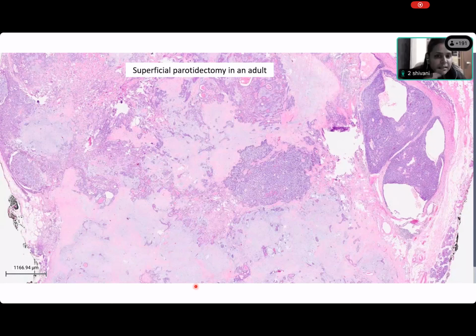Ma'am, there are cells which arrange in light and dark. Light and dark. Okay. Akshara? On the right side, there are these lobules of basaloid-looking cells. Basaloid-looking cells on the right side. Yes. And what do you mean just by basaloid-looking cells? What are you seeing? The blue, basaloid-looking cells are just sitting there.